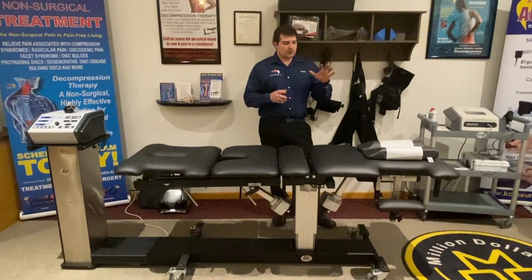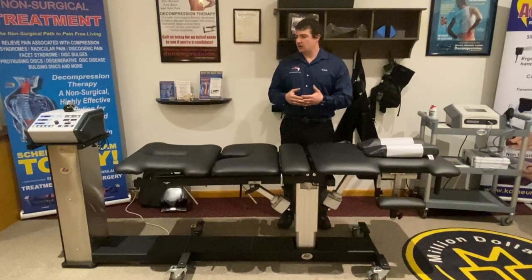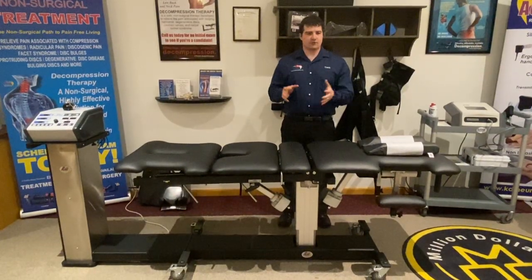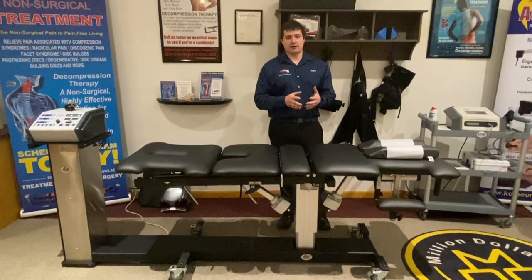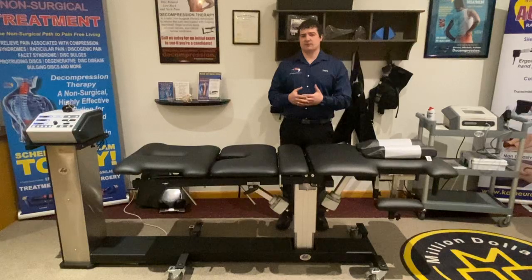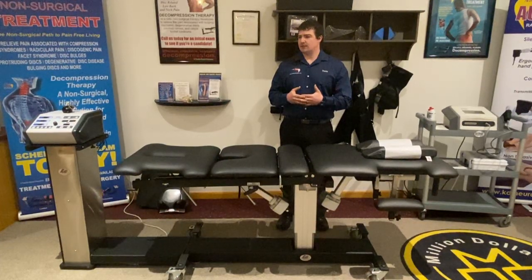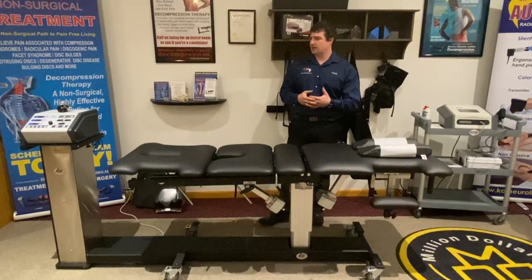We want to talk about our table design. This is a quick demonstration video of basically the important features of how the NeuroFlex came about. We're incredibly proud of this. We've worked on it for 25, 30 years. Many of our different doctor instructors have been in the field using this and developing different products and features along the way.